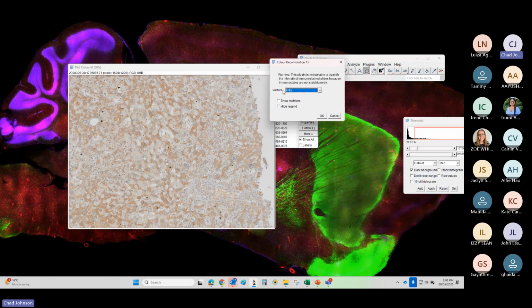Now these are our stain vectors. There are a whole lot of different pre-loaded stain vectors, and it's the usual common ones. So H&E, they've got an H&E 2. I think you can use one or either depending on the stain intensity.